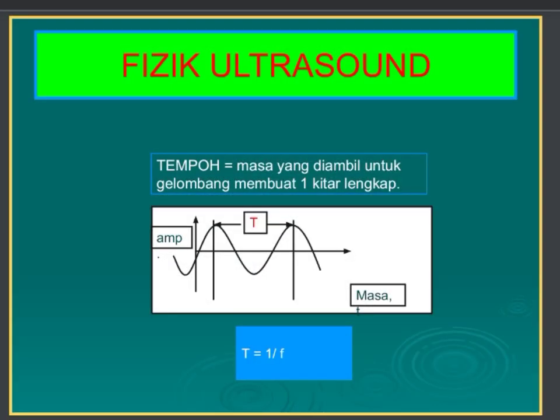Tempoh ialah masa yang diambil untuk gelombang membuat satu kitar lengkap. Okey, kalau contohnya daripada puncak kepada puncak seterusnya, ini dinamakan sebagai satu kitar lengkap.